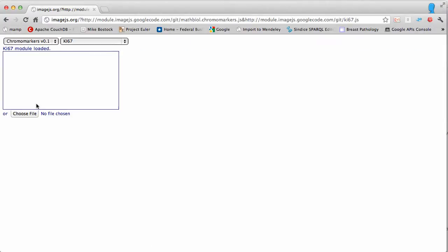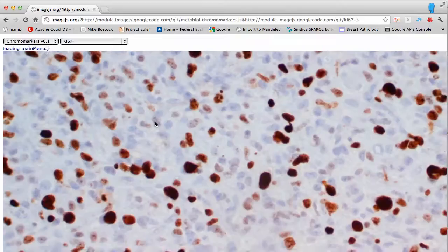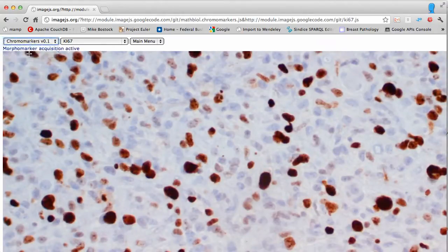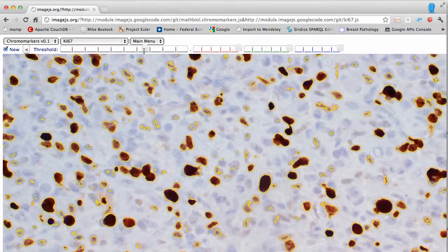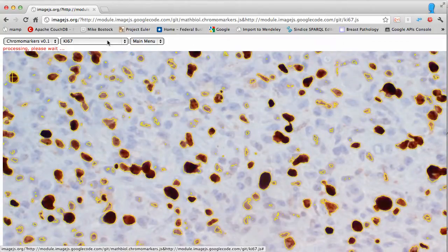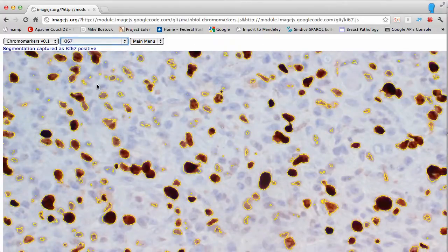For a new image, just click reload to reset the application. This image looks already clearer than the previous one, so activate chromo markers. You could start by segmenting the ki67-labeled regions — it doesn't really matter which one goes first. The browser is not slowing you down at all; this is a very efficient environment to do image analysis.